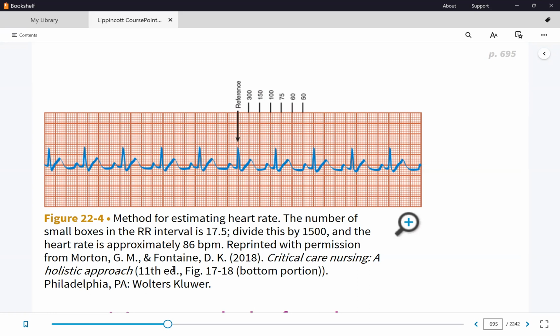Okay, let's do it by hand. So let's establish our 6-second strip. So 1, 2, 3, 4, 5, 6, 7, 8, 9, 10, 12, 13, 14, 15. Okay, 15 will be right here. Can somebody mark this? Maybe use the tip of the marker there.